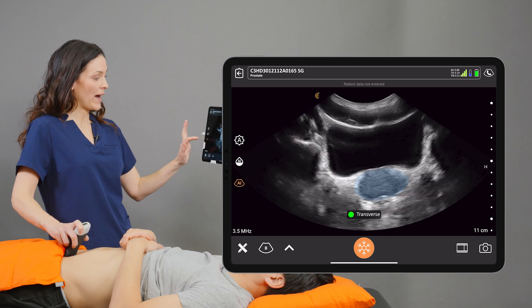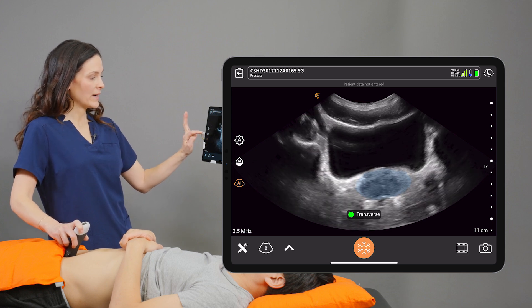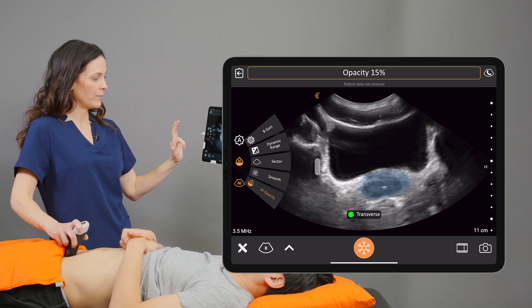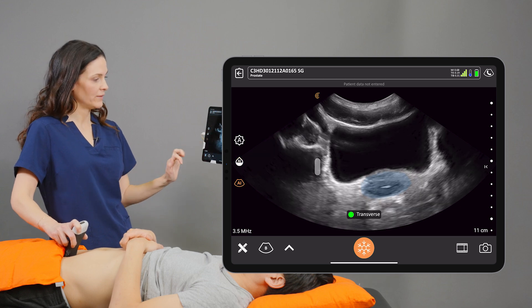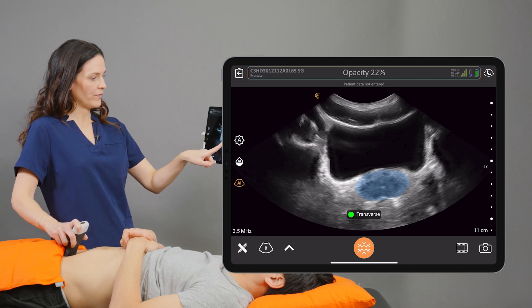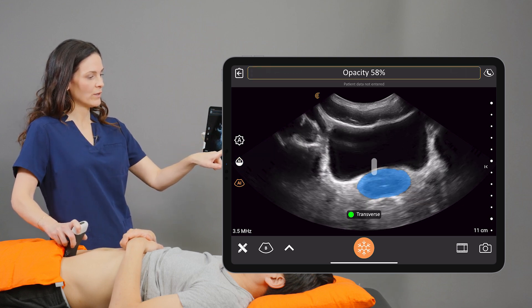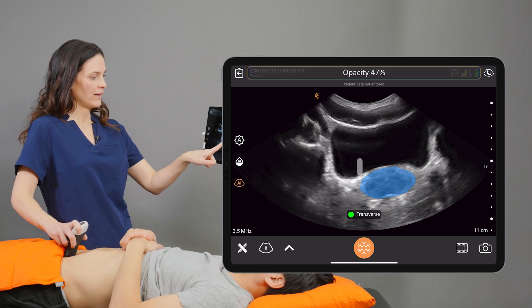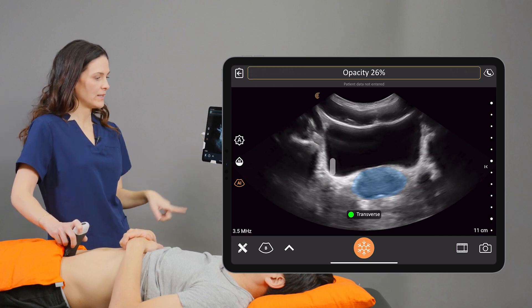I can adjust the opacity of the masking overlay by selecting the AI teardrop icon and selecting AI opacity. When I drag my finger on the screen to the right the opacity of the masking is increased, and to the left the opacity is decreased.